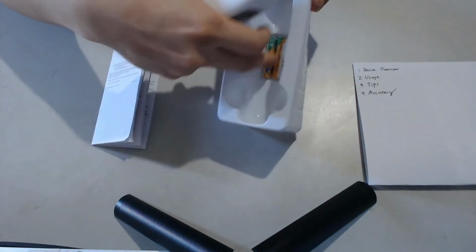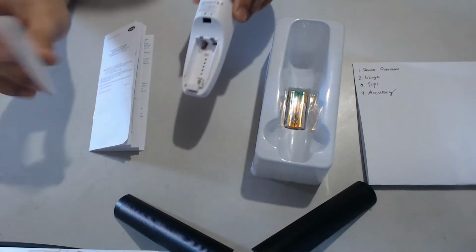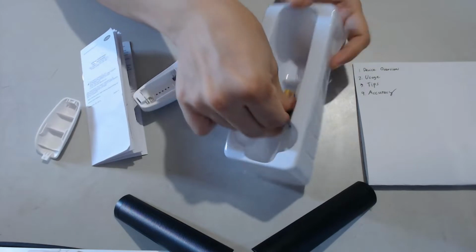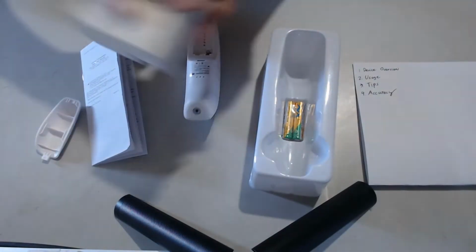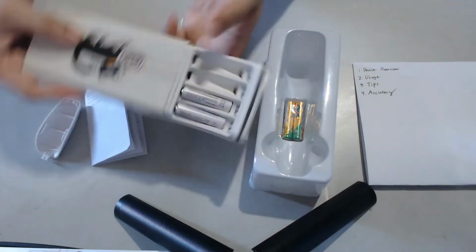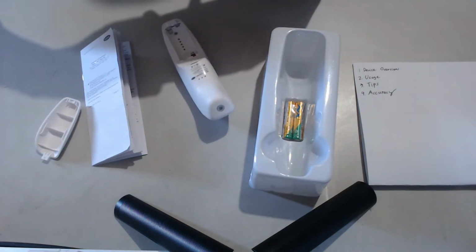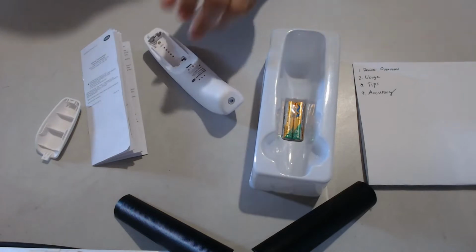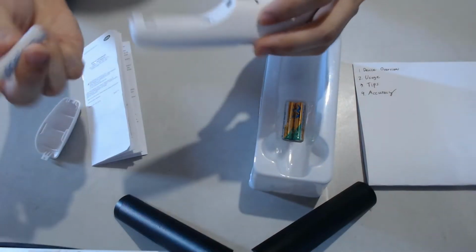So it has batteries, it's AAA. You open this, put in AAA batteries. I won't be using this. Instead, I have some Eneloop AAA batteries, which I will use in here.